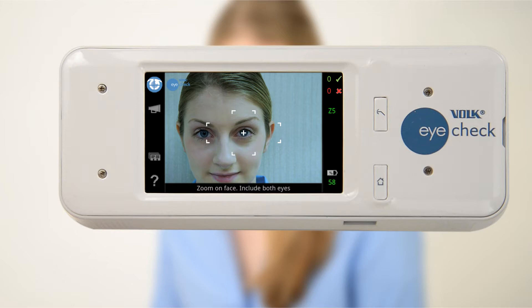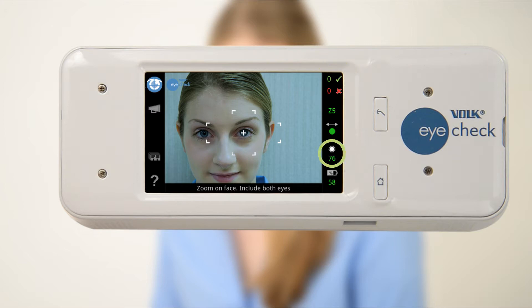Eye check is equipped with a responsive user interface to provide feedback throughout the measurement session. In the top right hand corner, there is a green check mark and a red cross. These icons indicate how many good or bad photos have been taken in the current session. The light level will also be indicated on the right hand side.